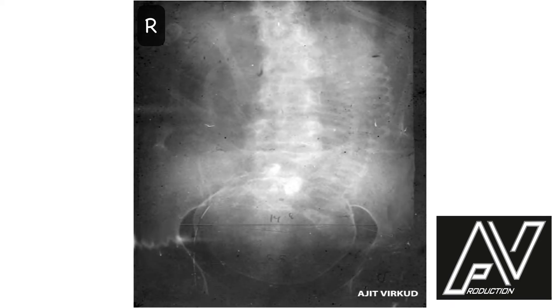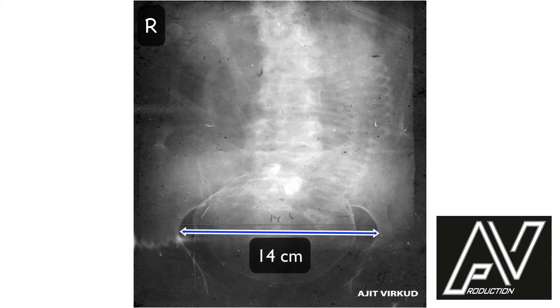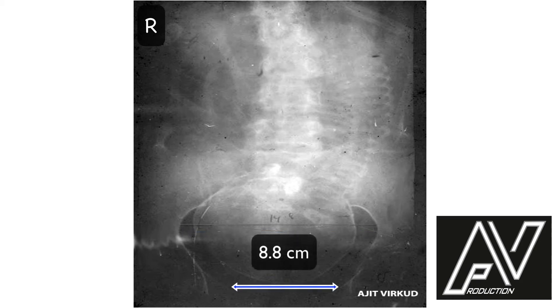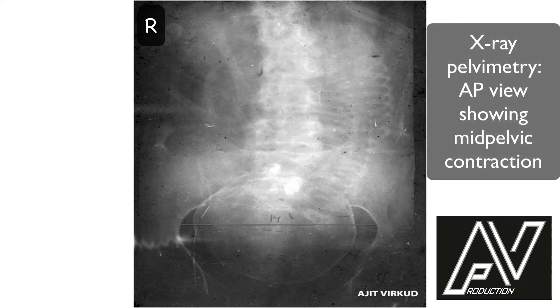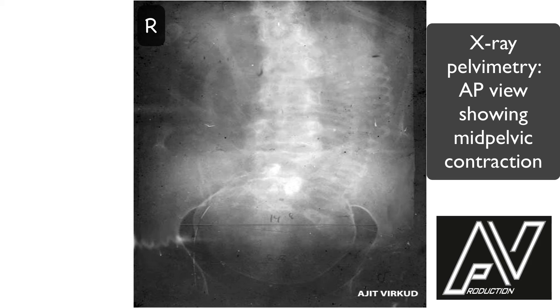This is a plain x-ray of the abdomen and pelvis, AP view, well centralized, well exposed, showing a single fetus in longitudinal lie, flexed attitude, cephalic presentation with vertex as the presenting part. In addition, the transverse diameter of the inlet is measured at 14 cm, and the interspinous diameter is also measured at 8.8 cm. Since the measured diameter is magnified, the actual interspinous diameter will be less than 8.8 cm. The shape of the inlet is round and the sub-pubic angle is not visualized in this plane. Therefore, my diagnosis is obstetric x-ray pelvimetry, AP view, showing mid-pelvic contraction.